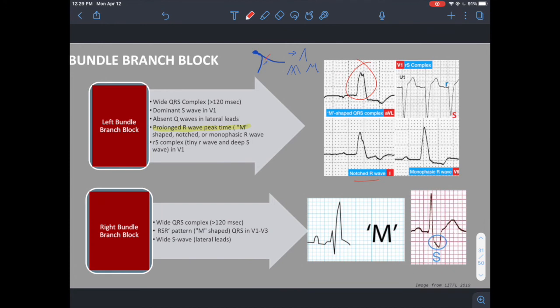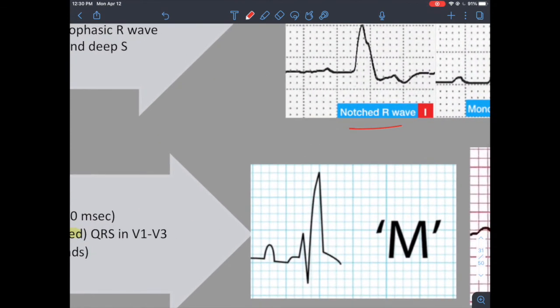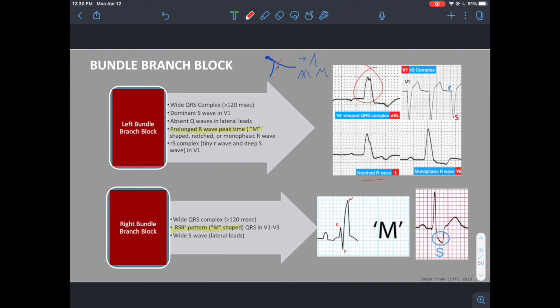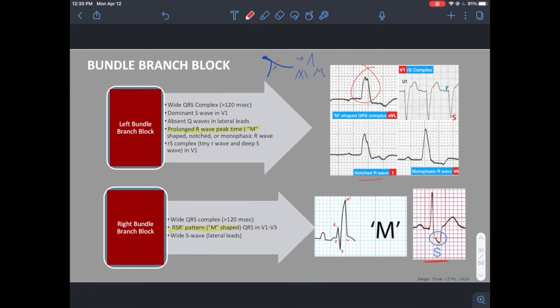Right bundle branch block has an RSR' (RSR-prime) pattern — R peak, then S peak, then an R-prime peak — representing the left bundle branch depolarizing then the right bundle branch depolarizing later. In lateral leads you may also see a wide S-wave. These are the key morphologies to note for bundle branch block.